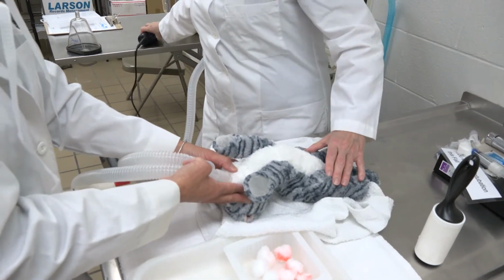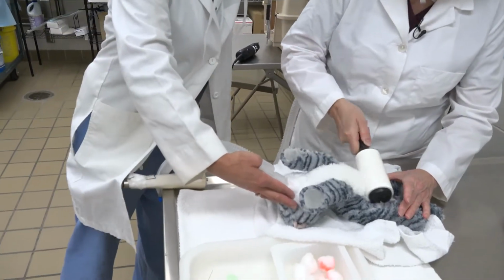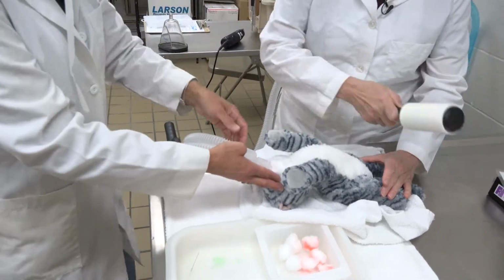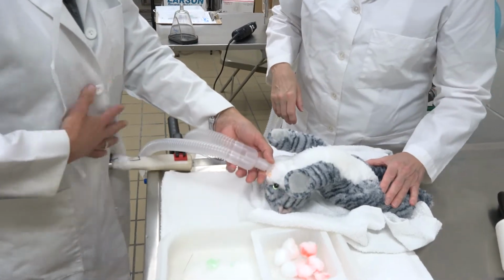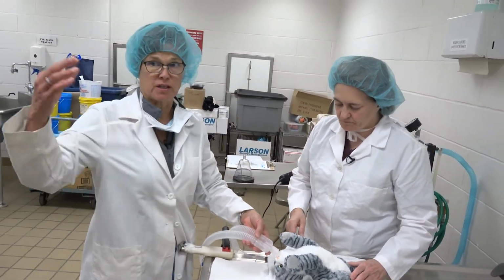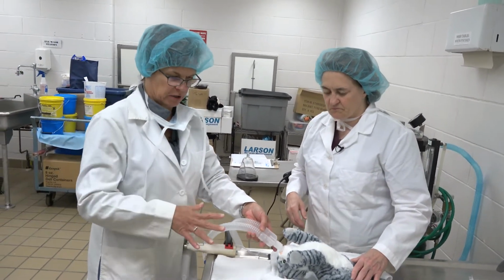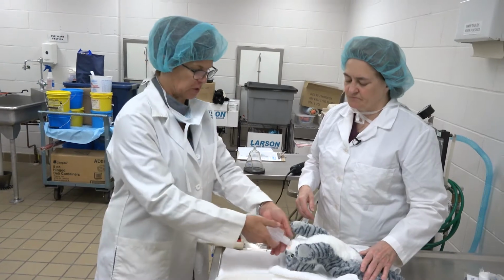All right, I think we're all set. I'm just going to get rid of some of these extra hairs. I'm going to turn the O2 off, and we're going to move into surgery. I'm going to take my lab coat off, put my cap and mask on. My lab coat's actually going to go into a locker. We don't want those strewn everywhere while someone else in our group is cleaning up the catheter supplies.